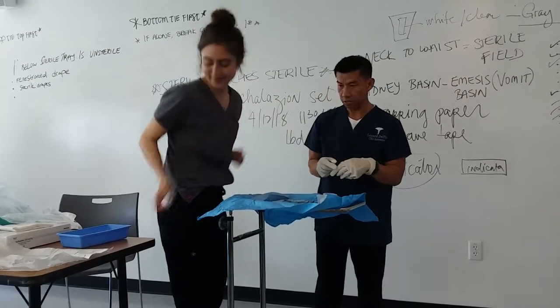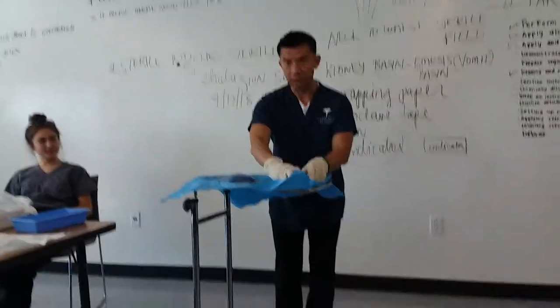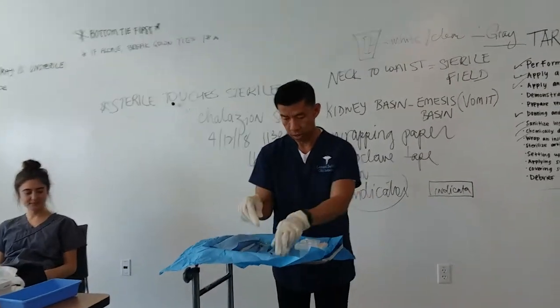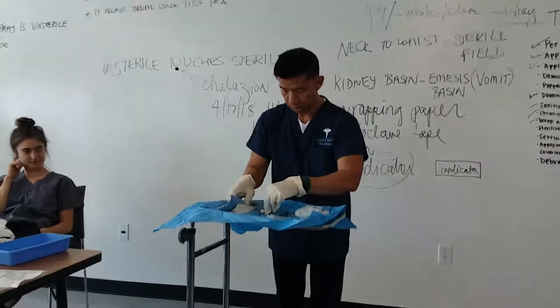I have my medication cup — this is for the medication. This is the syringe, so syringe and needles go together. I'm putting them to the side.